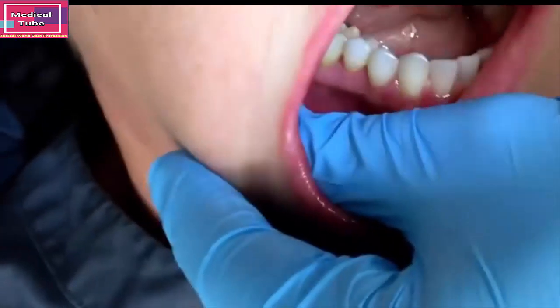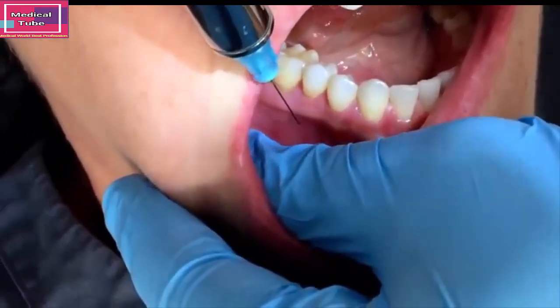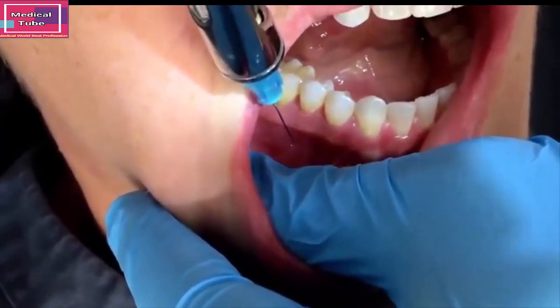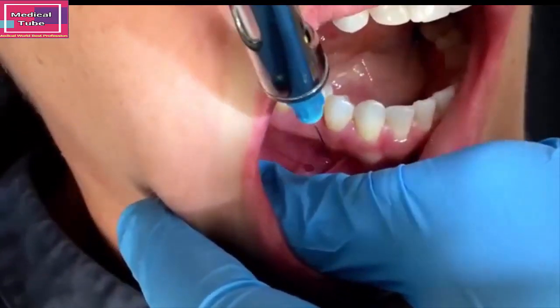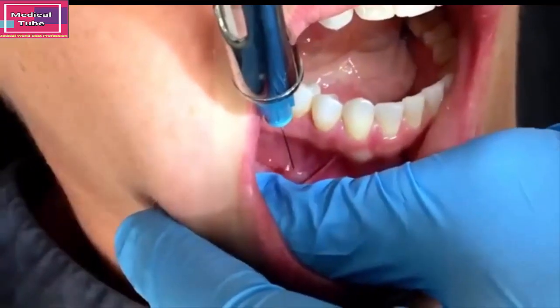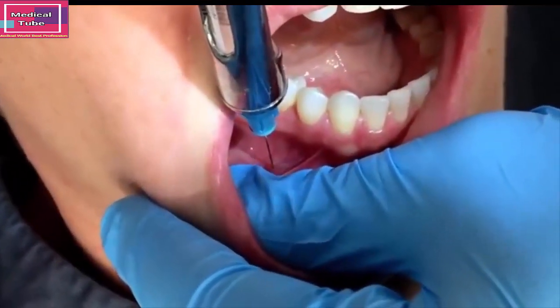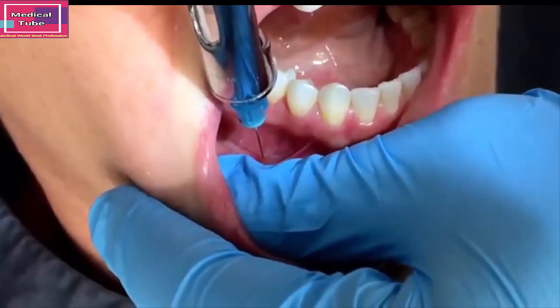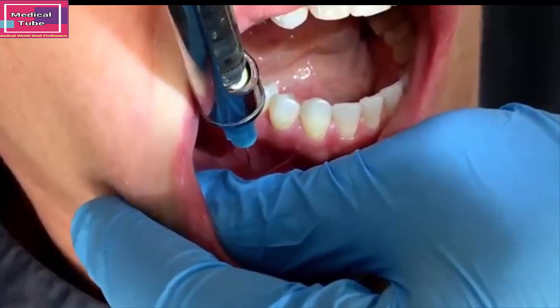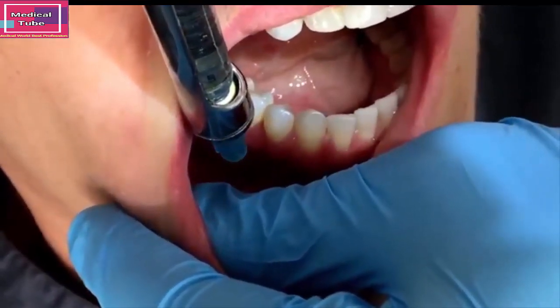You want to be aiming between the 2 premolars. You can also look at your x-rays and see where the mental foramen is on your particular patient. Does it go a little closer to the first premolar? Is it a little closer to the second? And when you enter right in between those 2 premolars, I go from minimum to maximum, and then I'm going to deposit about 1/4 to 1/2 of the cartridge.